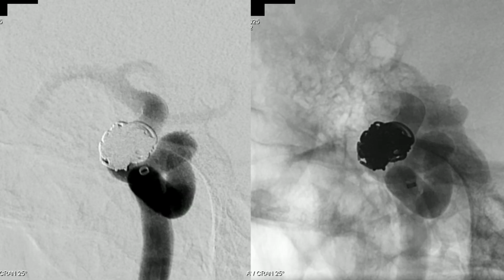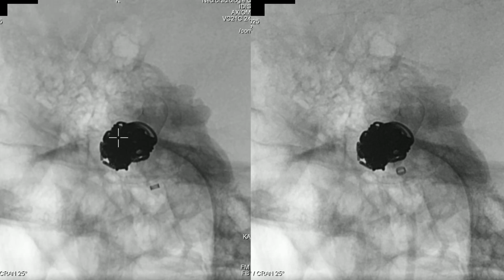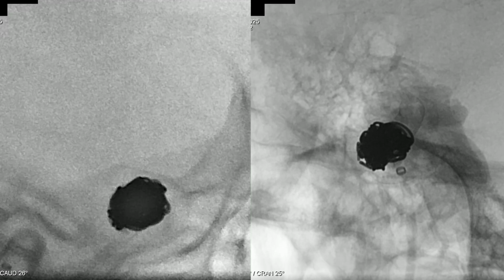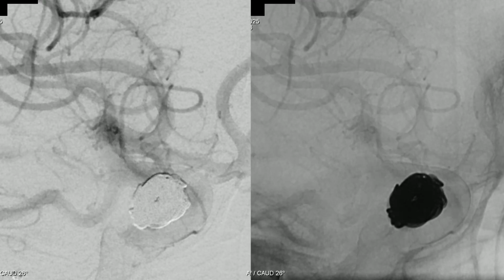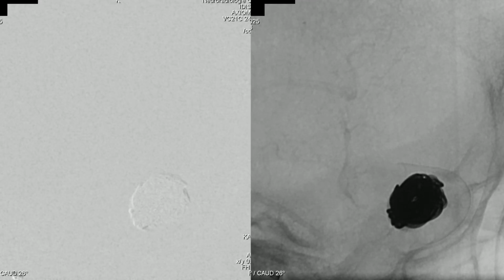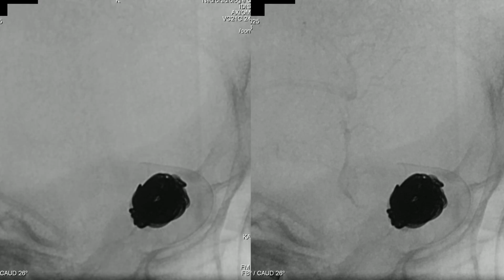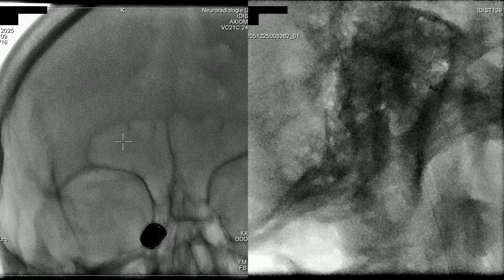And now we check our results from another angle, and as you can see, the flow diverter is well opened, and we need another projection for the proximal end of the flow diverter. And as you can see, the flow diverter is open very well. And here we have our results with the background, and we can see the flow diverter and the coil package very well. And now we need an overview to exclude complications.